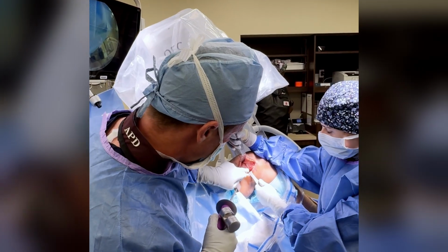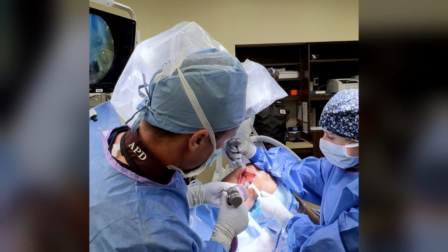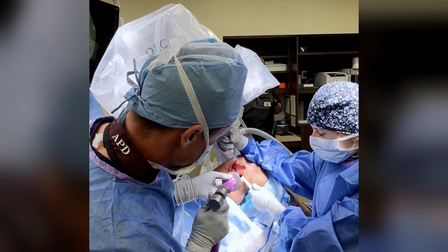Okay, so we can see we've created our osteotomy there. This is a little Christmas tree, a wedge that we're gonna wedge into the osteotomy and make sure it opens up. So I just place that where my cut is and gently mallet.